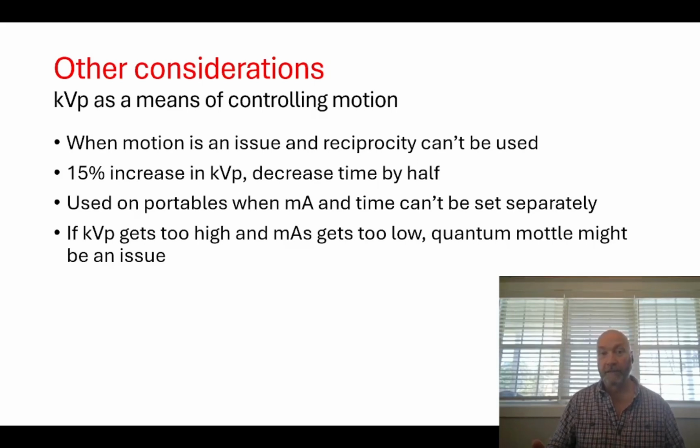And they look at you and say, it's going to be too light if you shoot at 110. They're absolutely inaccurate, because at the lower kVp, what you're going to get is a longer exposure time.